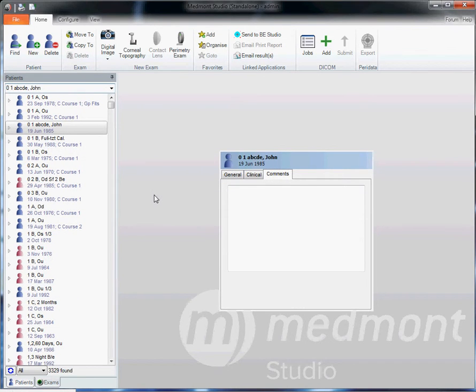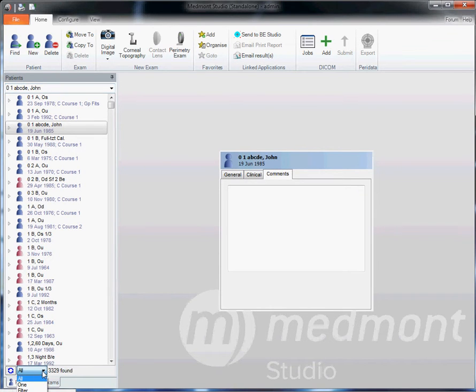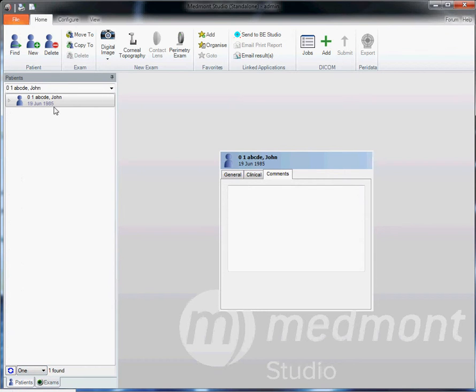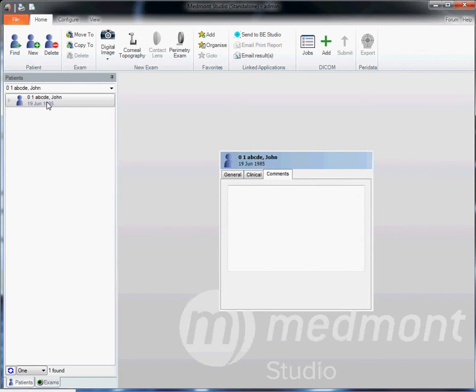If you'd like to do a filter and only show one particular patient, select from this pull-down menu, one, and it highlights and allows viewing of only that one particular patient.